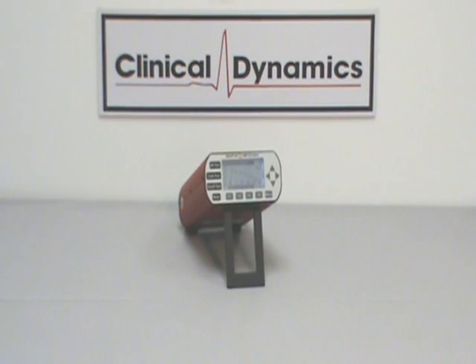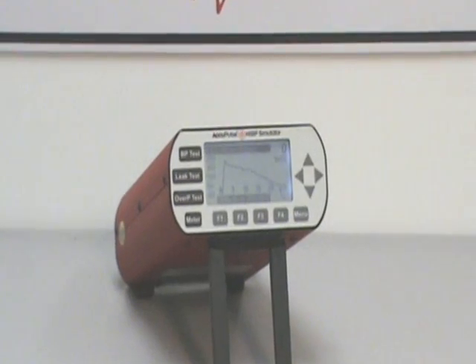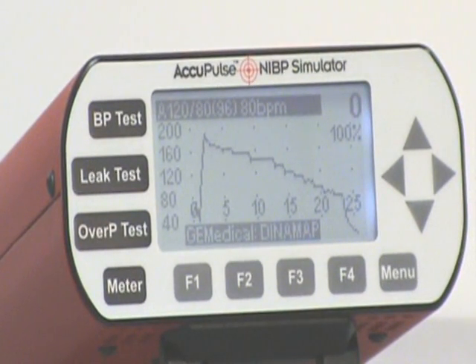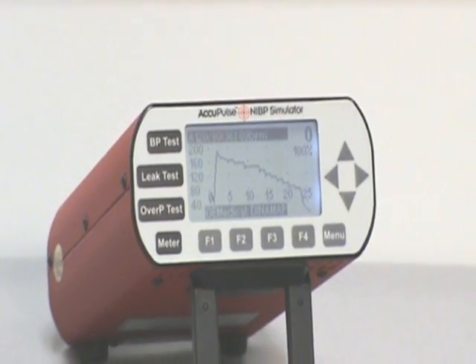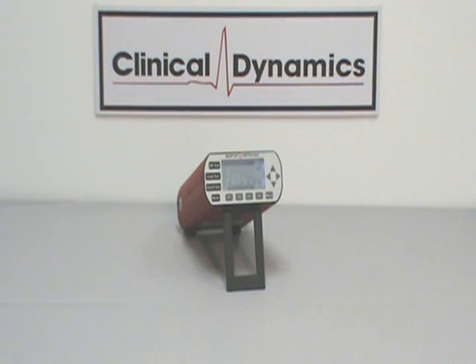This is a video presentation of the handheld version of the Acupulse Non-Invasive Blood Pressure Simulator Test and Calibration System. This device is lightweight, portable, and durable. Clinical Dynamics Acupulse Technology has 30 years of development and experience in the field of medical blood pressure testing and simulation.